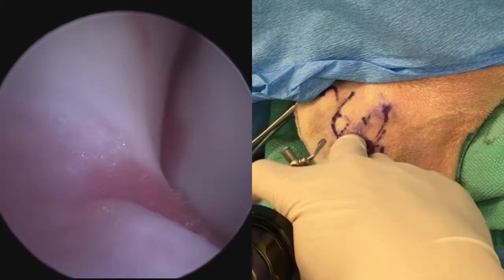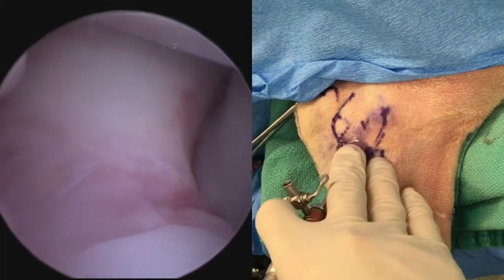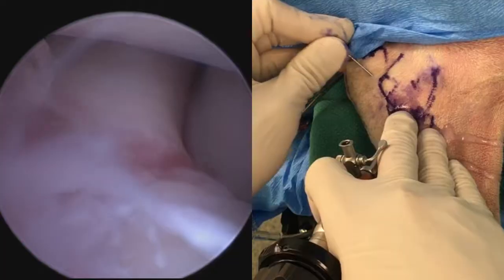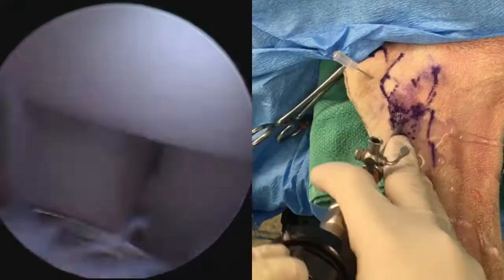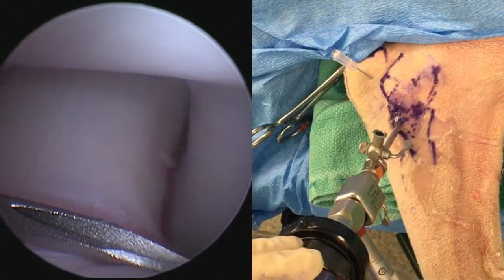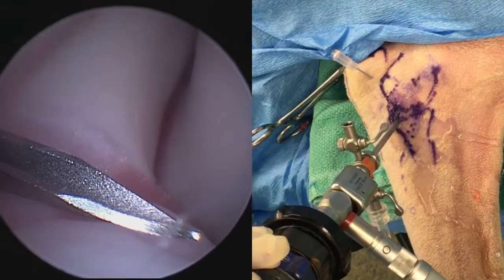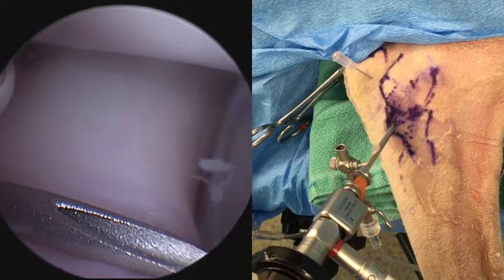The blunt obturator with cannula is introduced into the joint. The first view is typically of the ulna notch region, and by having the light post in the cranial direction, we can look up caudally. An egress needle is placed just caudal to the medial epicondyle, and we are ready for our joint exploration.